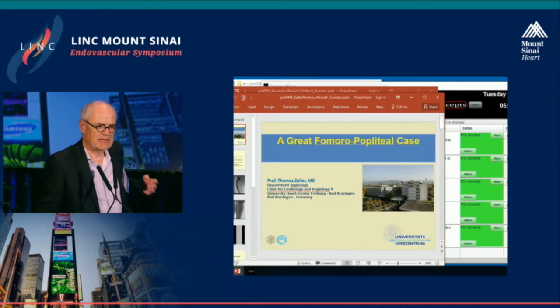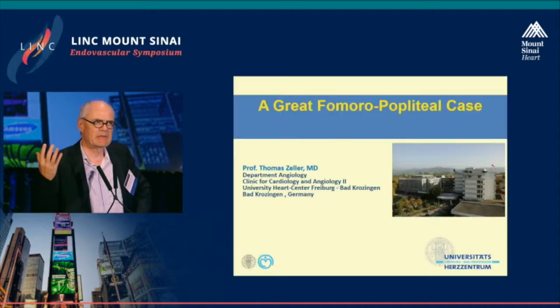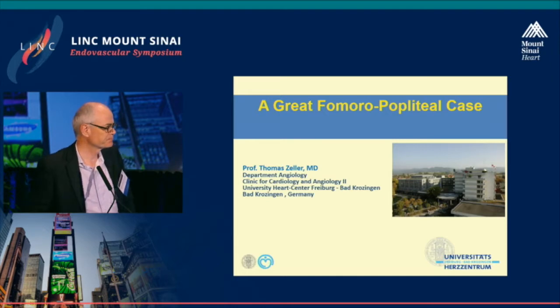So this was the case, not very spectacular as mentioned, but I believe it's a very important case with regard to illustrating the background and the significant benefit of the use of lithoplasty in the near future.